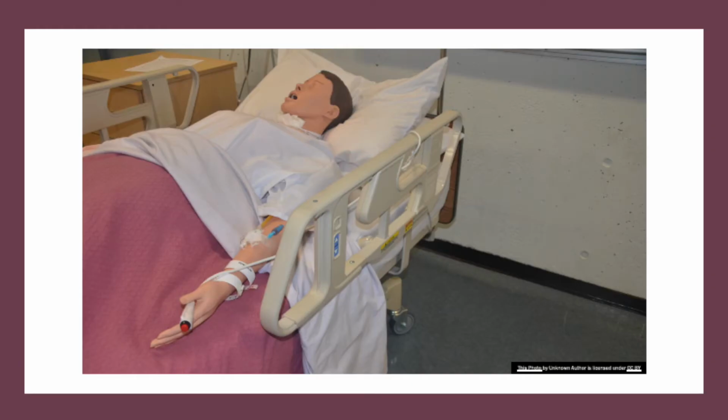Tell the patient to remain nice and still whilst you take the recording. Make sure to transmit the ECG to the patient's record and print a copy. Ask the patient if they are experiencing any chest pain during the recording, and if they did, make sure to record this in their notes.